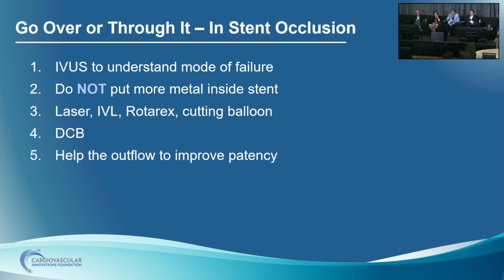Something happened along the way, but they keep coming back and back and back. So small vessels, just like any small nitinol stent. Exactly. You did what you could here. I think it's a good result, and they're going to heal wounds, and then you're going to start thinking about your surgical or other options if it keeps coming back.